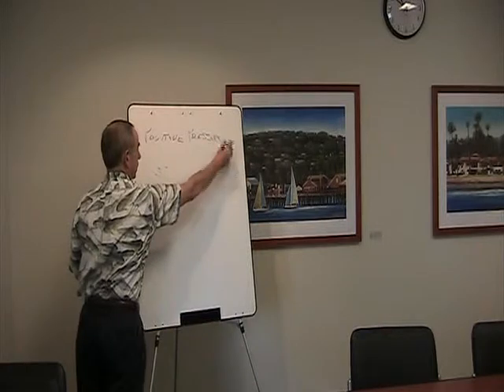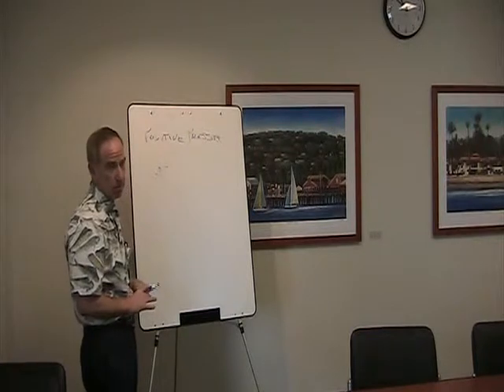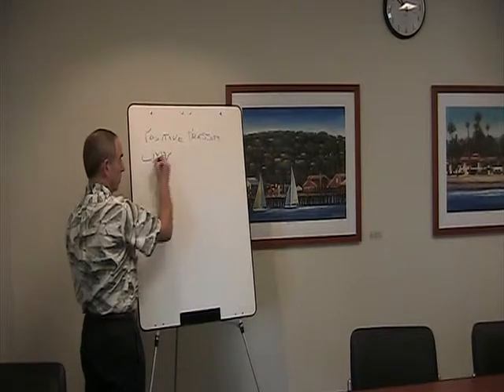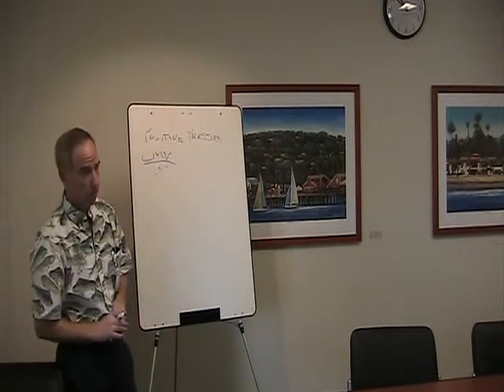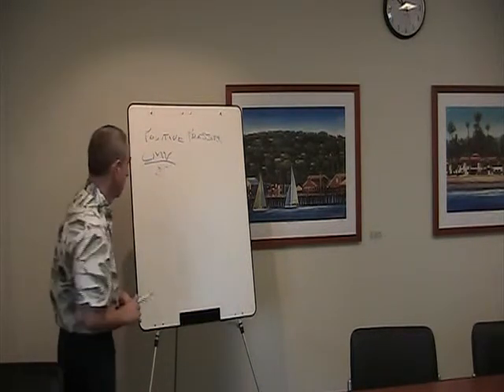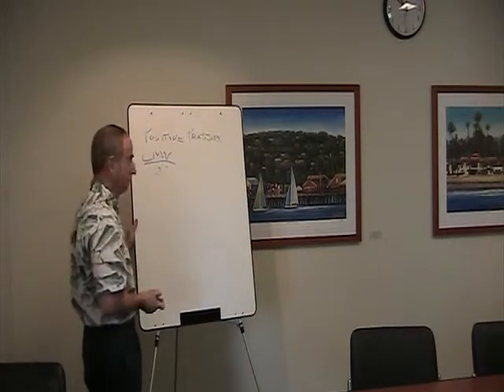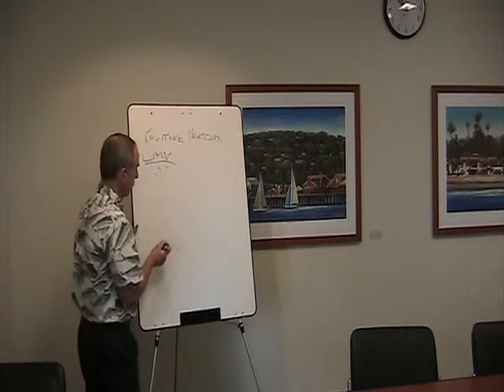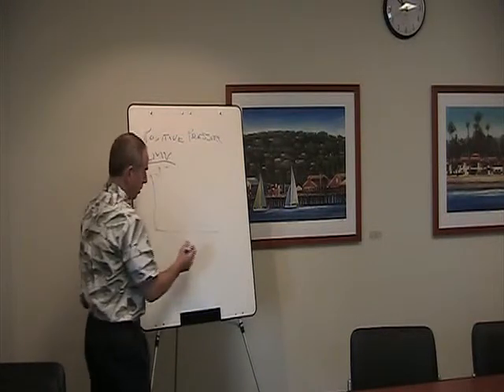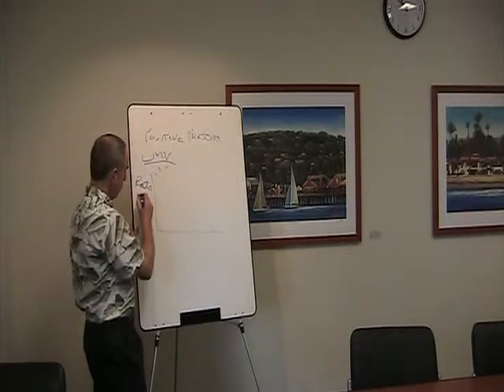And the mode of ventilation, what was the initial mode of ventilation that they had at that time? It was only one mode, and that was CMV. What does that stand for? Continuous mechanical ventilation, or controlled mechanical ventilation. Sometimes it's controlled mandatory ventilation. People use the same letters for different things, but it's basically the same type of ventilation. So this was a positive pressure ventilation where you would set a rate and you would set a pressure.